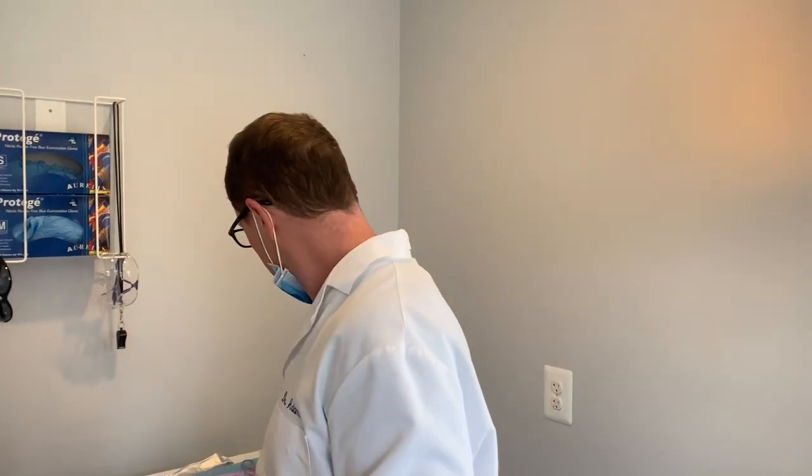And now that the patient's numb, it's a two-rooted tooth, these lower molars. I'm going to separate the tooth into two pieces so I can carefully remove it one piece at a time. And once the tooth is removed, it's really important that you remove the periodontal ligament. So we will take an instrument called a curette, and we will remove the PDL. It's almost like a peach fuzz type connection that connects the tooth to the jawbone. And oftentimes with a dead tooth, there'll be some scar tissue. The body will grow a little cyst that'll wrap around the root of the tooth. And it's really important that you remove that tissue. That tissue actually grows around the root to prevent any bacteria or dead tissue from leaking into other parts of your body easily. So we want to get that out of the way, get the periodontal ligament out of the way. And once that's done, the bone cells can migrate into the area and grow new bone.